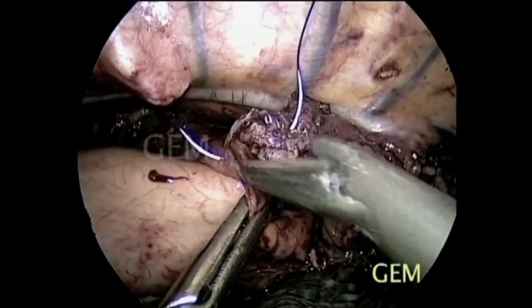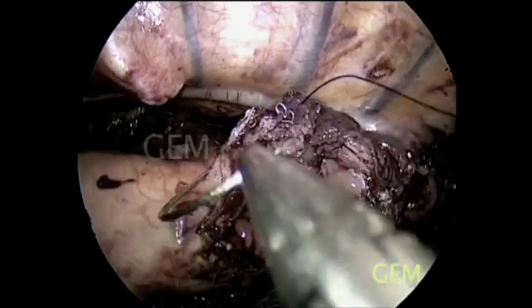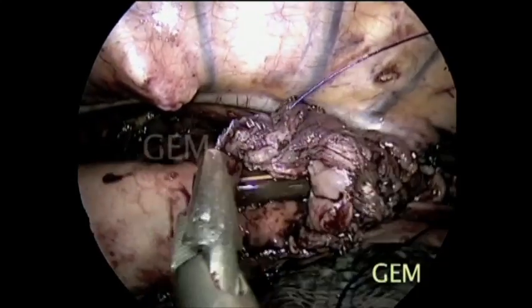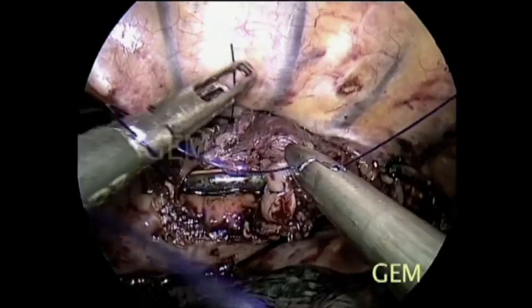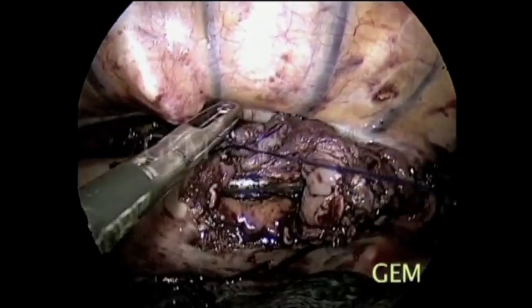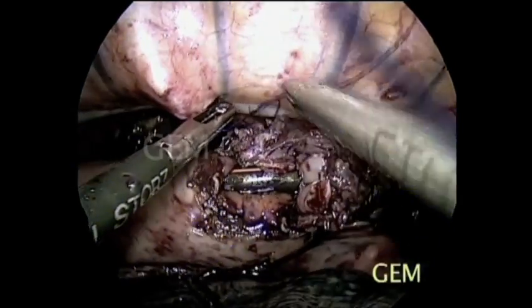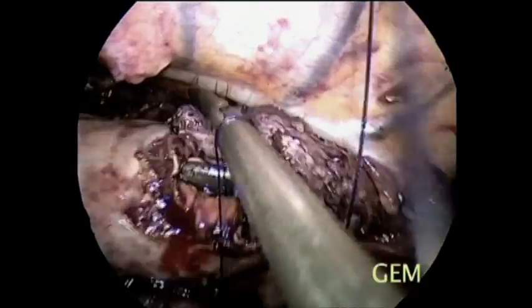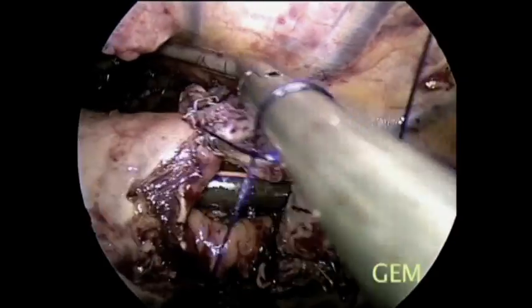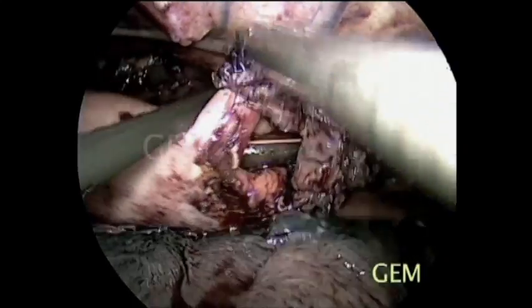This is PDS 3-0, but for bulky muscle one can use 2-0 PDS as well. We prefer interrupted suturing starting from the left end and coming across. One can appreciate the nasogastric tube has been placed across the stoma, which we keep postoperatively for irrigation and decompression.